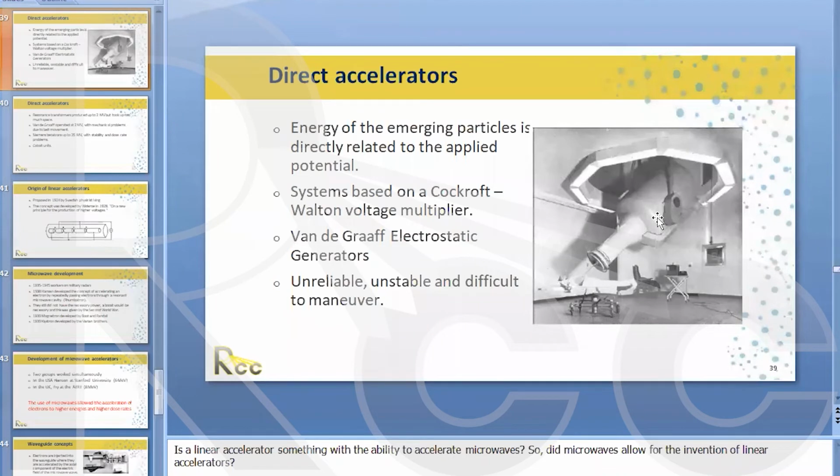Ideally, you deliver it in a very, very short treatment time, so there's less motion. And you deliver it under control with multi-leaf collimators. So how you deliver that dose becomes very important. But if your dose rates become very low, then the treatment times become too long. I'm not concerned so much about the biology, because at those dose rates, the biology is pretty much the same. But the big concern is going to be patient motion.